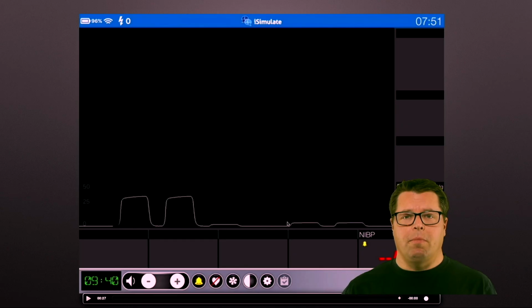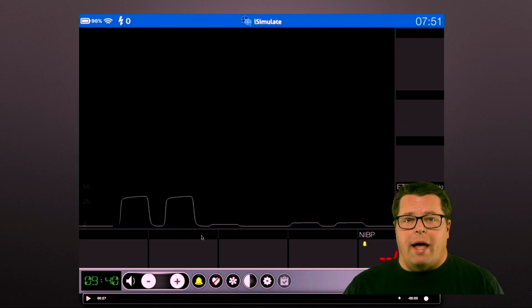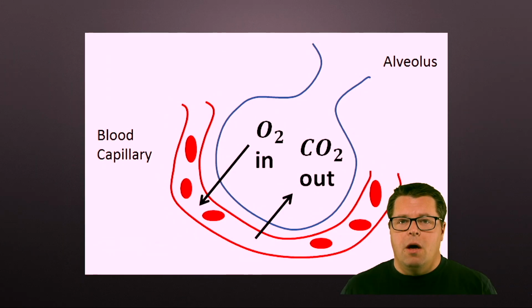The patient coughed it up, gagged it up, it got pulled out, moved around, occluded, something happened. If there was a waveform and now there's not, now there's no airway or gas exchange, and you've got to fix that right away. You cannot say that things just broke.